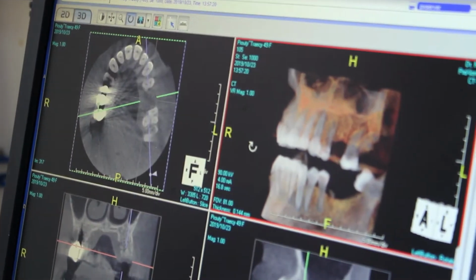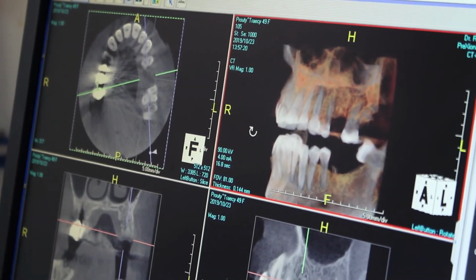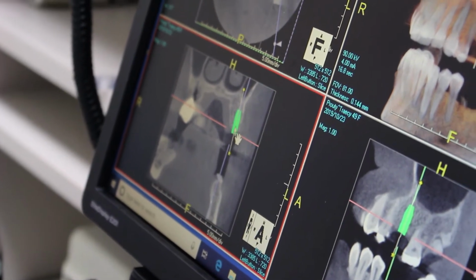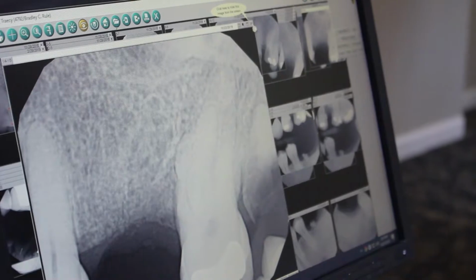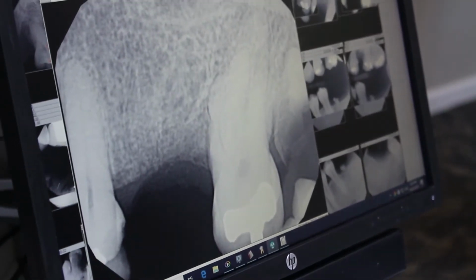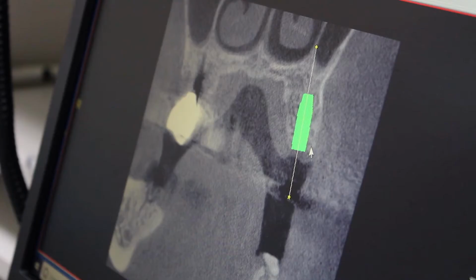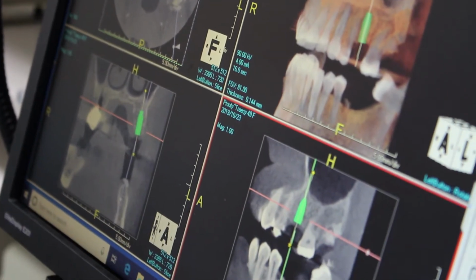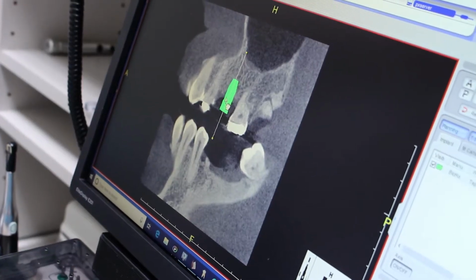It's important that we see the width, the height, and the overall circumstance in which we're going to be placing this dental implant. We want to know where the nerves are. We want to know where the sinuses are. We want to know where blood vessels are. And it also helps us to pick the right size of dental implant that we will use.